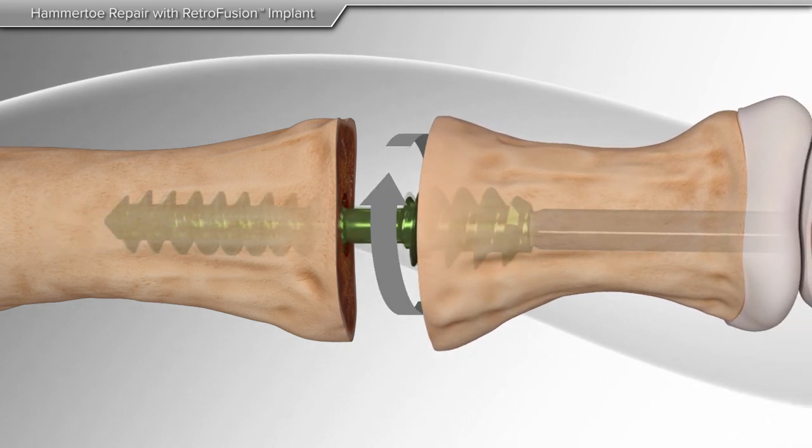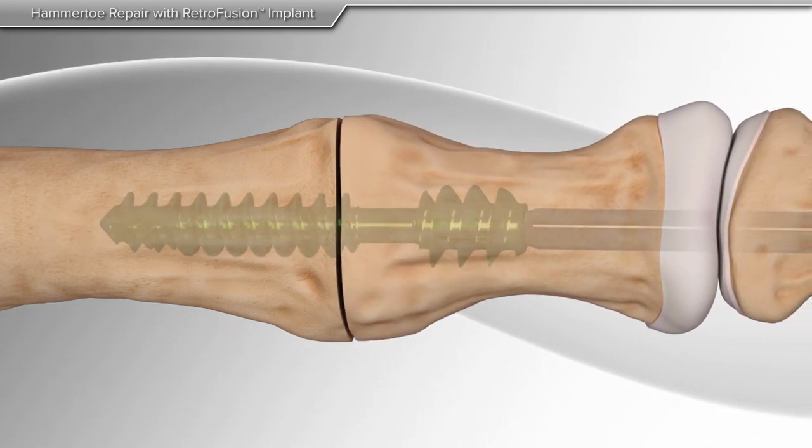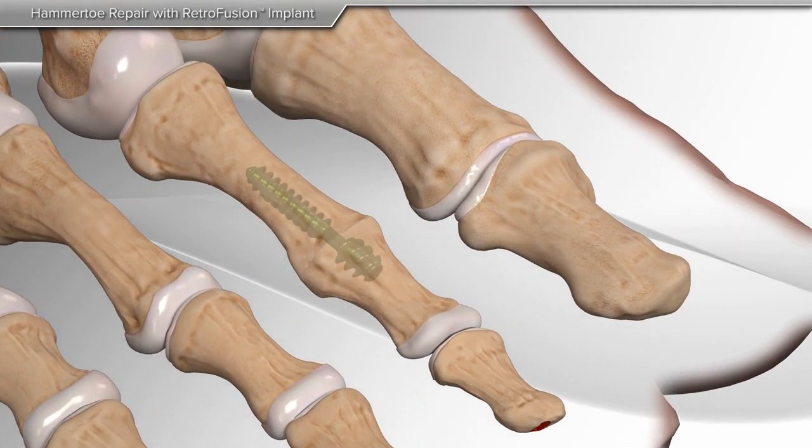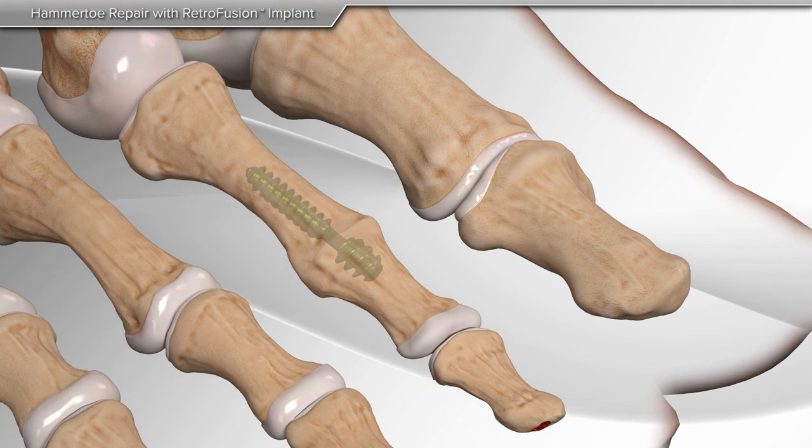Lastly, the screw is then turned clockwise until both bones are secured in place. The driver is then removed and the incision is closed, completing the procedure.